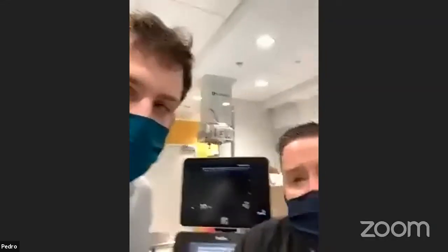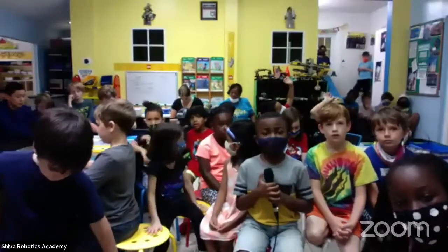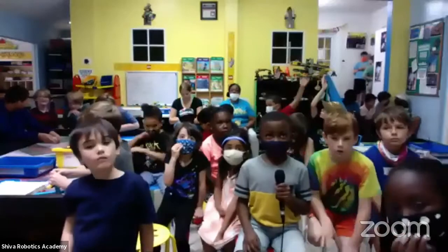Yeah, so we have two different ones. We have a probe that goes on this ultrasound machine, and they can look at your heart through that probe. So it looks similar to that camera, but it emits sound waves that show the image, just like he showed you the vessel on his neck. They would do the same procedure. It's called a TEE exam, and they go just down your throat right to your heart, and then they see the heart. They don't go inside the heart, they just go in your throat, and it can see the heart.